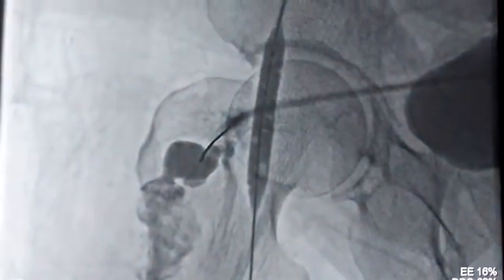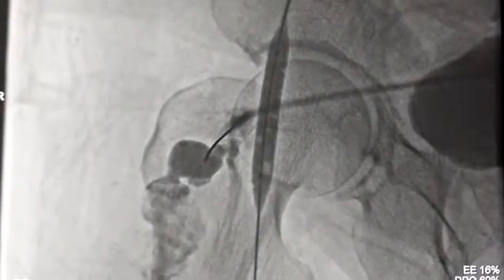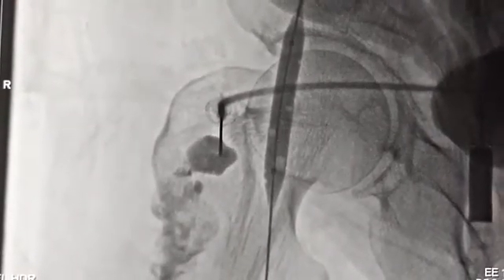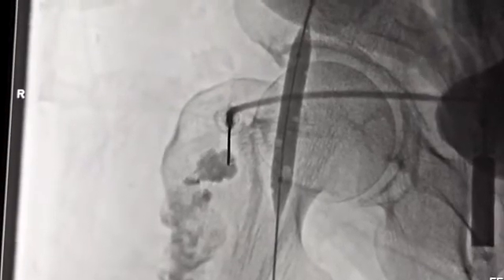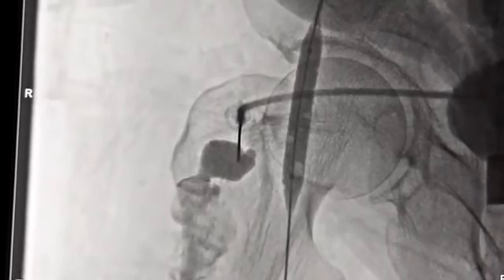We are going to inject glue nicely over there, and our target is to come back with the glue to the stalk a little bit, so that we can achieve a complete cure of this pseudoaneurysm. Now we can see the glue has entered into the pouch nicely — if you just see the injection of the glue, it looks beautiful — and coming back a little into the stalk where we just stopped it.